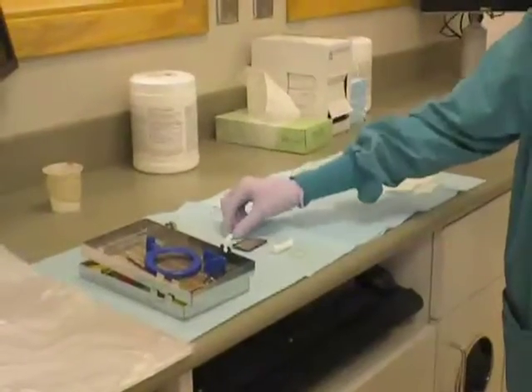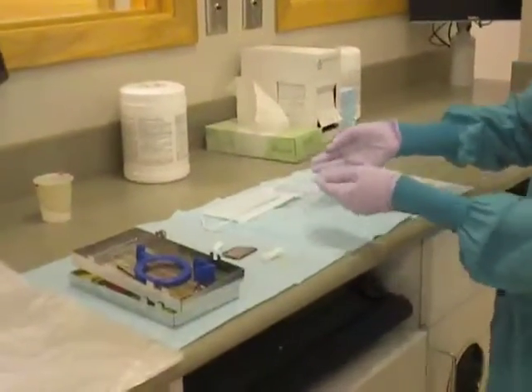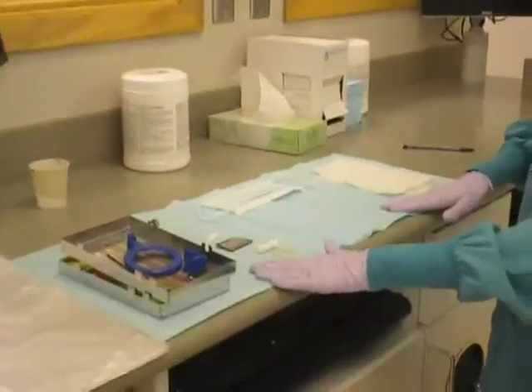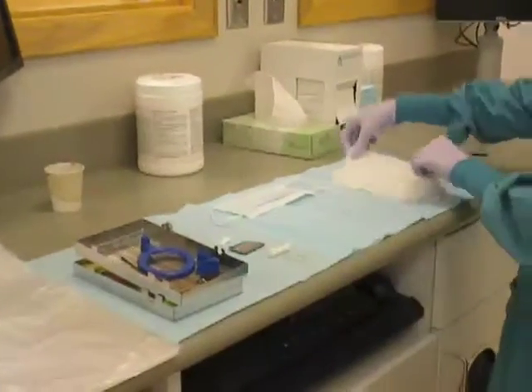Also collect optional stickers that aid fitting the plate into the bite block, a pair of gloves, an optional mask, a cup with phosphor plates, two blue napkins, barrier tape, a chair bag, and a Kleenex to wipe off the phosphor plates.